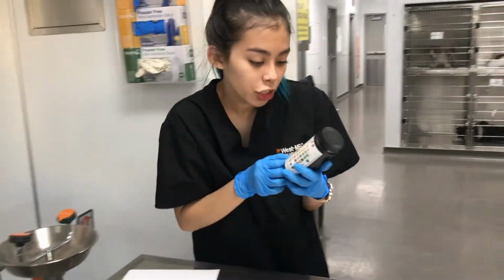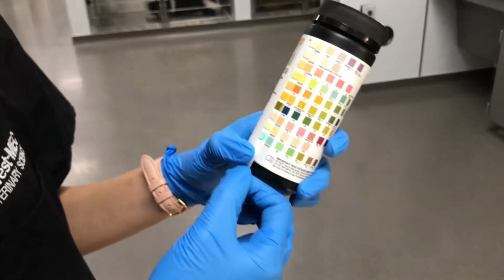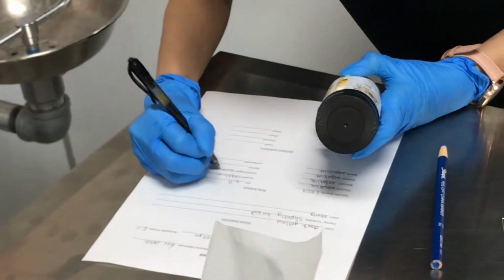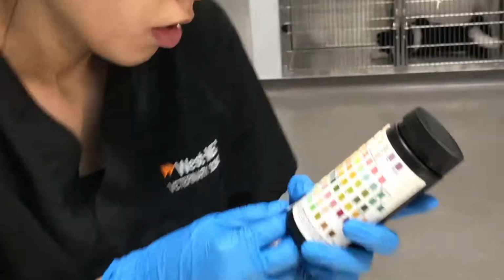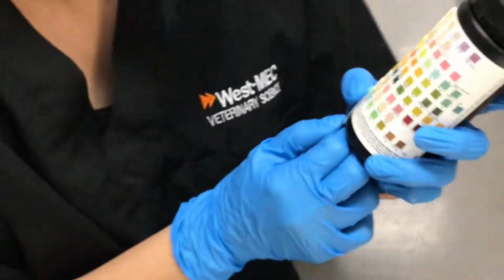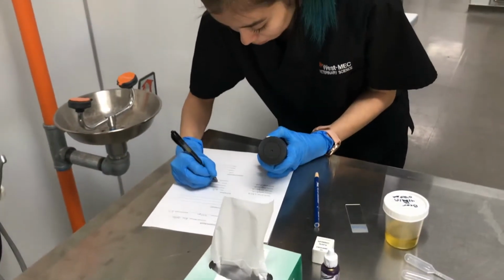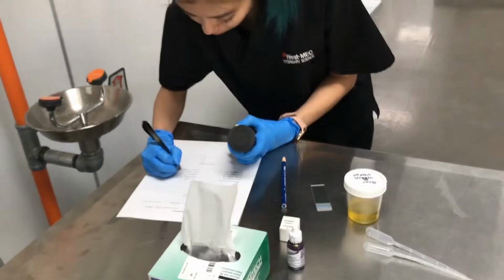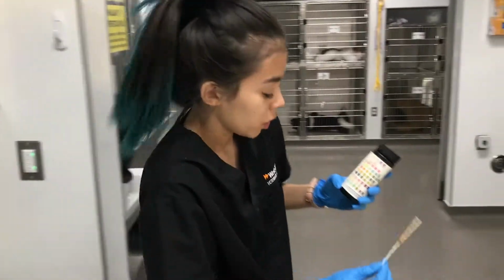For urobilinogen, that matches normal. For nitrite, it also matches negative, and for leukocytes, it matches negative. So once I'm done reading the chemical assay strips, I will dispose of it.